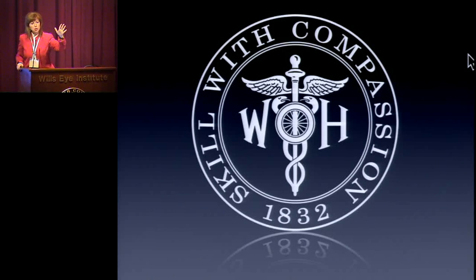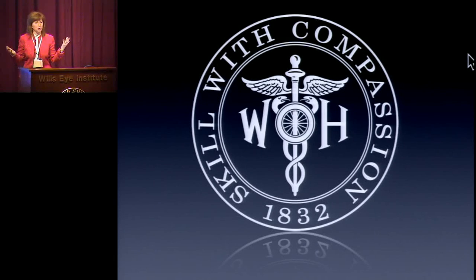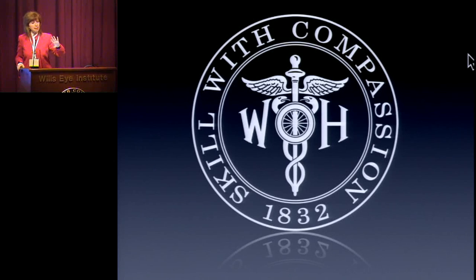And their pressure is 22, but their corneas are 580. You know, these people don't have glaucoma if their pressure is 17 or even if their pressure is 27, unless, of course, they have other risk factors. So if the OCT is a little abnormal, I won't buy that totally.